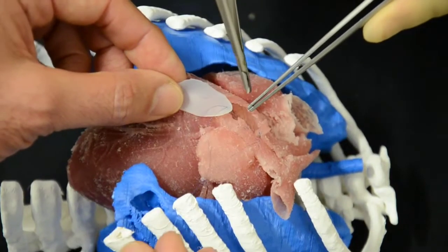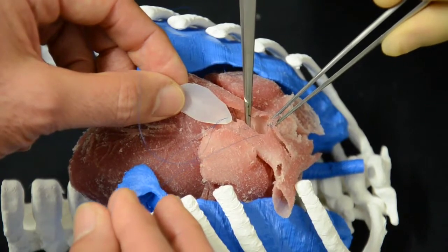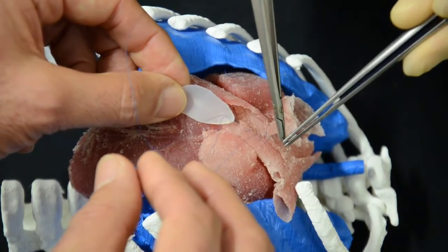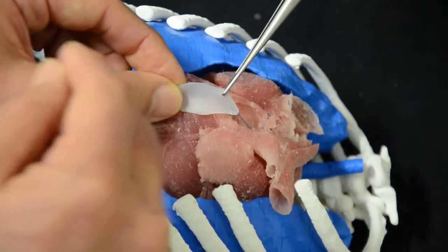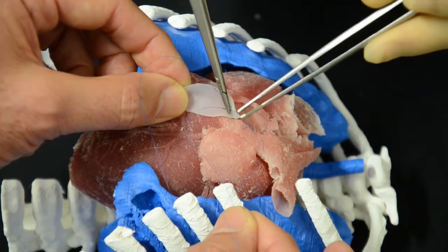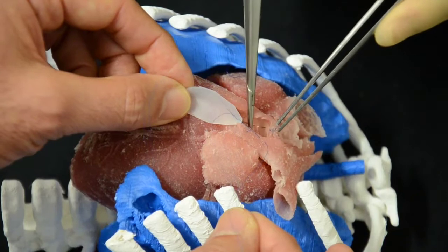So what we want to check here is if the material that we are using resembles the normal body material. I think that you can bring it down after this.